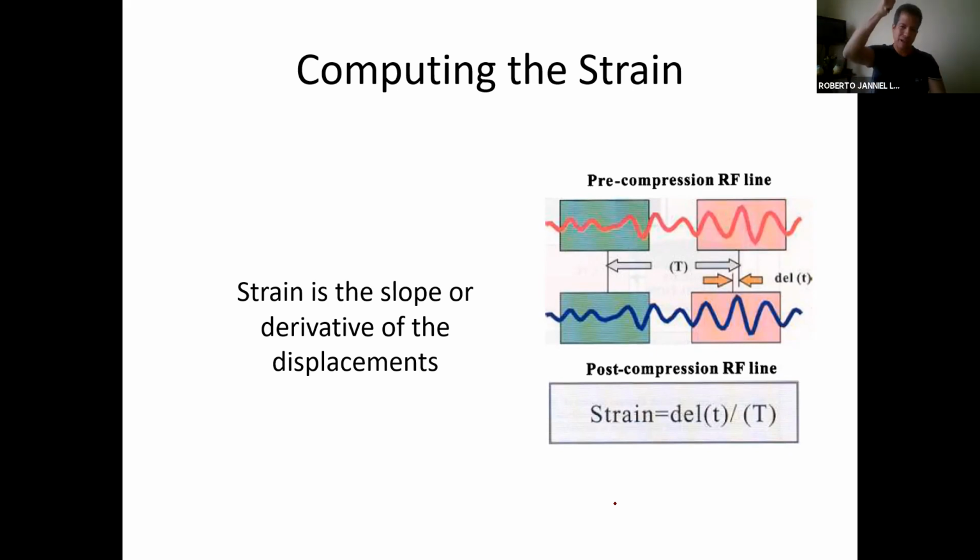So if you apply a lot of force, you decorrelate a lot, which is very similar to doing Doppler imaging with pulsing very slowly. If you just wait for a really long time, chances are you missed it. Your signal is highly decorrelated. With compression elastography it's the same thing, but kind of the opposite. You're trying to push things so you see more deformation, and eventually you only make things worse.